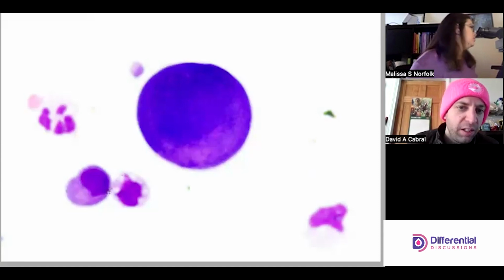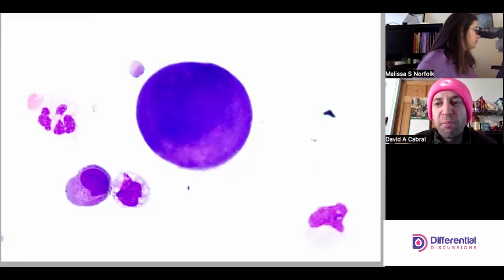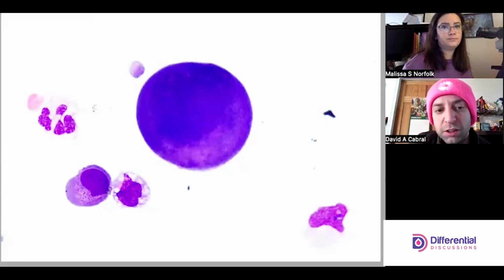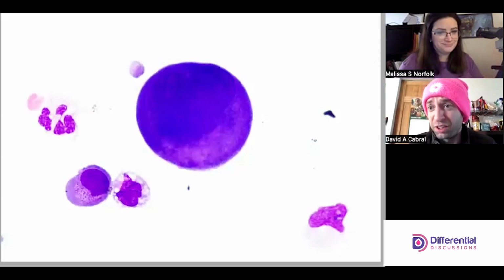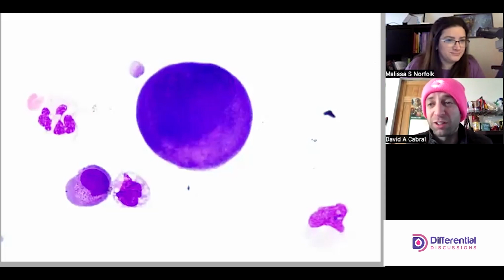If we think about it from how the viewer sees this, if you ever see a cell like this, where you can't determine where cytoplasm ends and begins, where the nucleus ends and begins, that can be troubling. The way in which cells stain is, of course, dependent on the stain. A lot of people will remake the slide. I've seen people just making slides over and over again, expecting different outcomes.